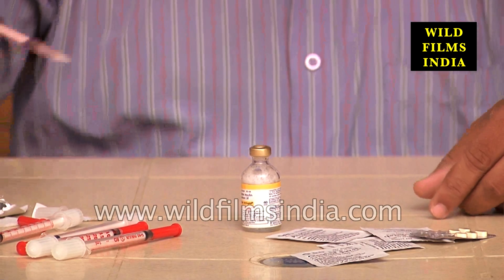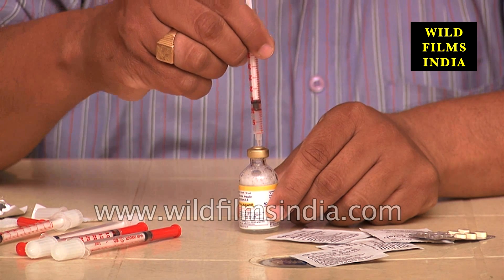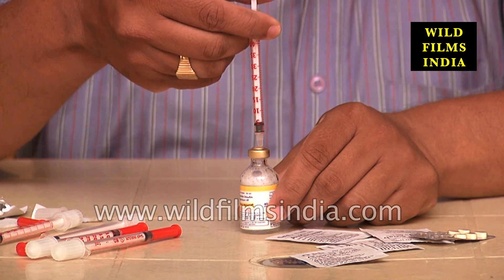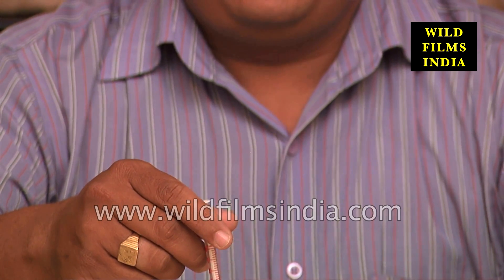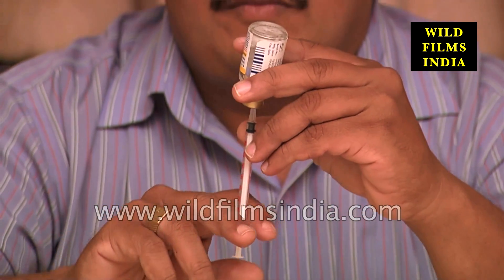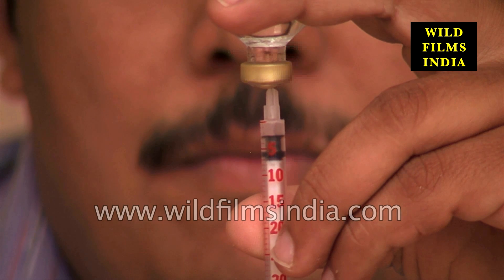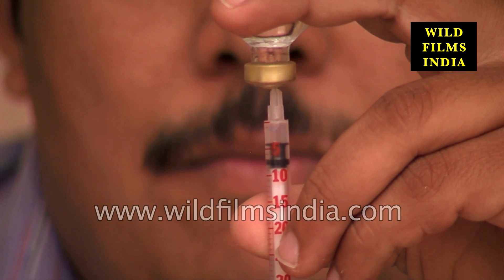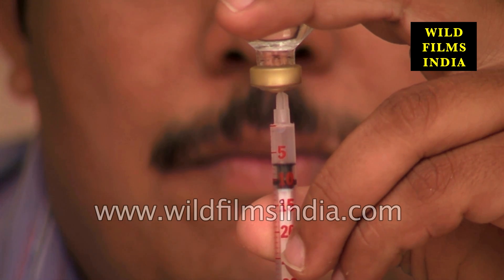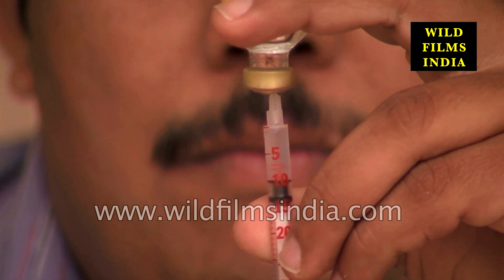Gently push the tip of the needle through the rubber stopper and push the air in the syringe into the vial of insulin by pushing down the plunger. With the needle tip in the vial of insulin, turn the insulin vial and syringe upside down. Pull back the plunger to get the desired dose of insulin. The end of the plunger should be at the same mark as it was when you drew in the air.